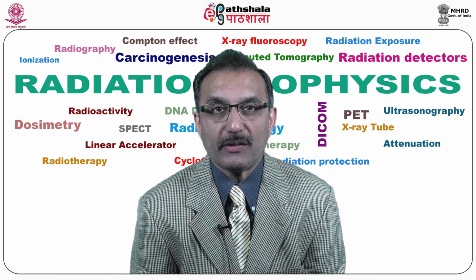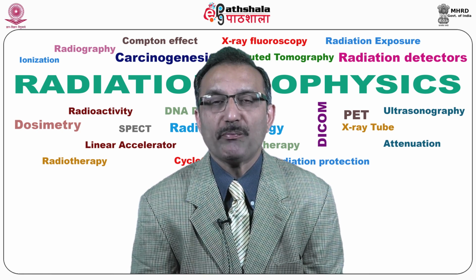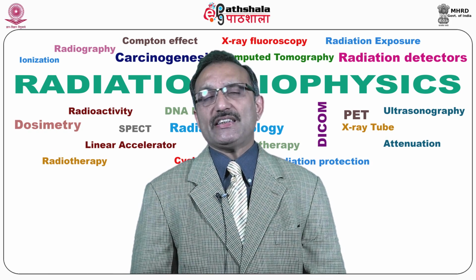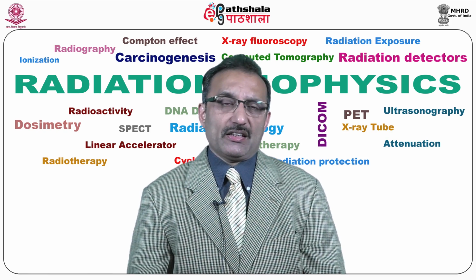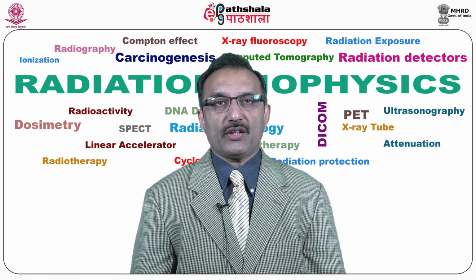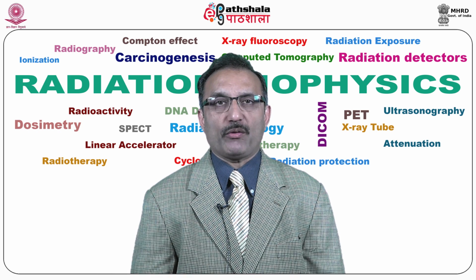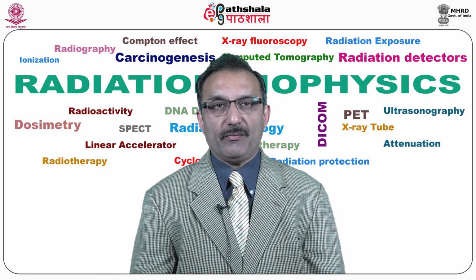The traditional approach is what? Obtain CT and PET images separately, then register the CT and PET images to help interpretation of the PET images. Either you have to register them separately, as I was discussing in the previous slide, or a mechanism has to be developed so that both are fused together, the images taken at one point of time of PET and CT, and you get a good quality image.